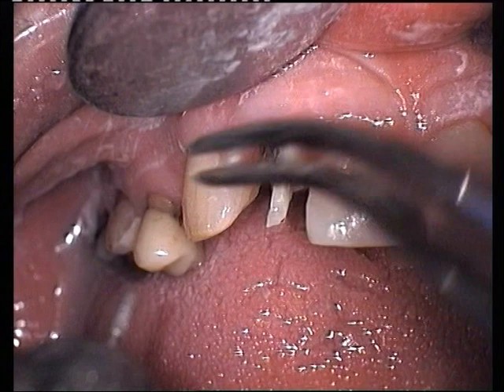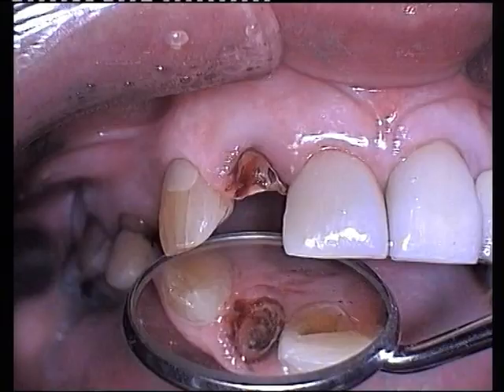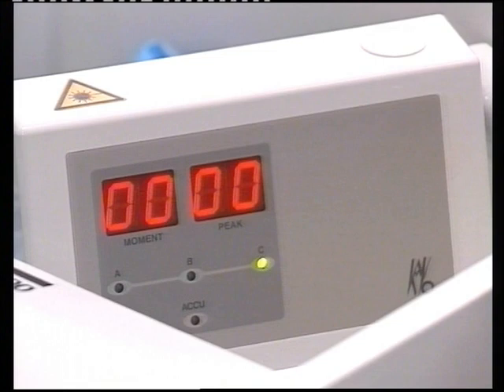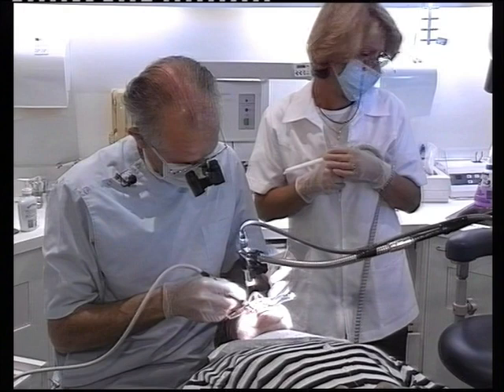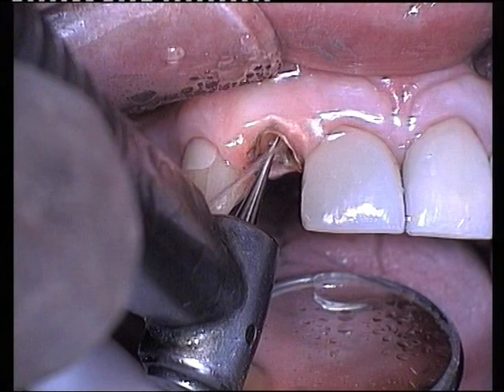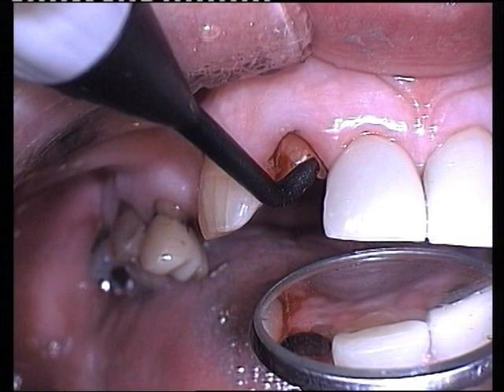Remaining resin tags can now be removed. Caries removal is carried out with a slow-speed round burr. A reflective laser diagnostic instrument, the CAVO-diagnodent, determines the extent of caries removal. Readings above 50 indicate extensive remaining caries. Further caries removal is initiated until a digital reading on the instrument of about 10 is achieved.